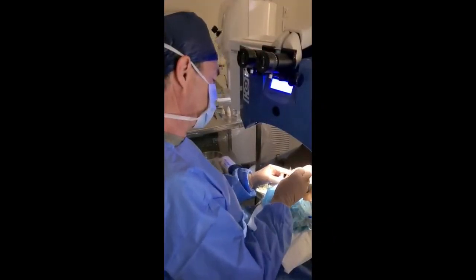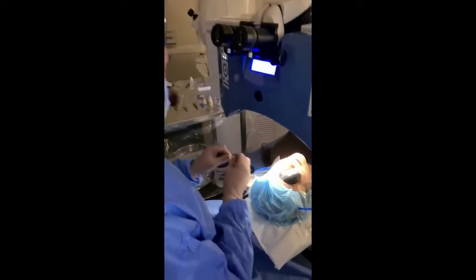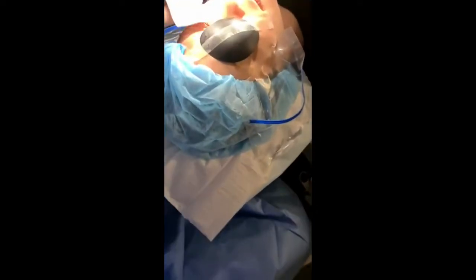Anesthetic eye drop. Like the anesthetic eye drop. Is that stinging your eye at all?